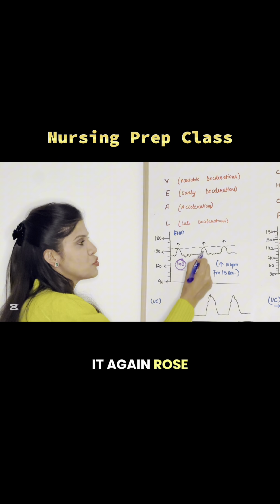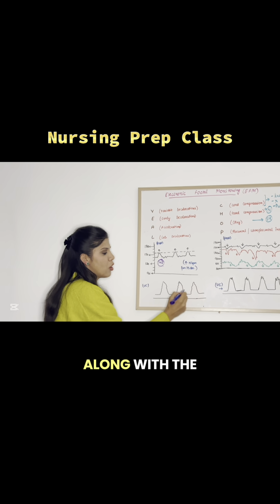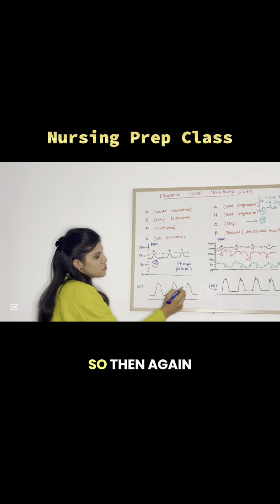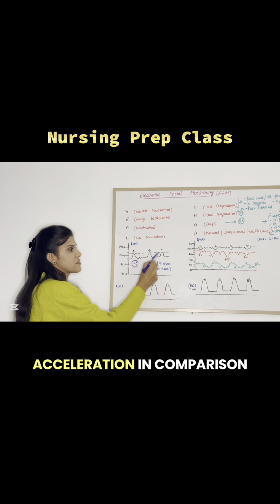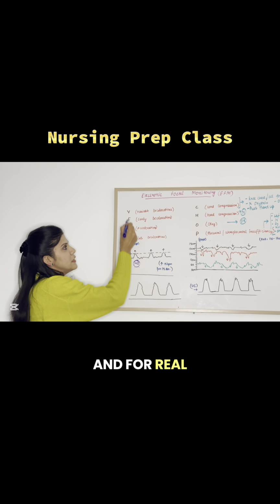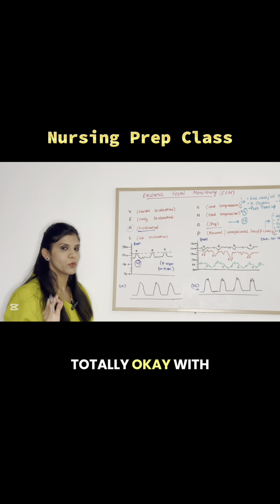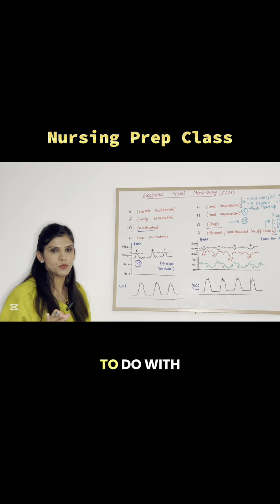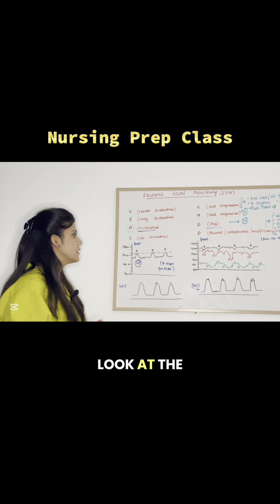And then again, another contraction came. It again rose to 155 beats per minute, and then again it started relaxing along with the uterine relaxation. So then again, the uterus got contracted, it rose up again. So this is acceleration in comparison to the uterine contractions. And for us, acceleration means they are okay. So we are totally okay with the accelerations. We have nothing to do with the accelerations. They are totally fine.